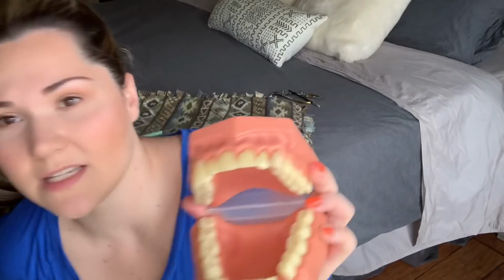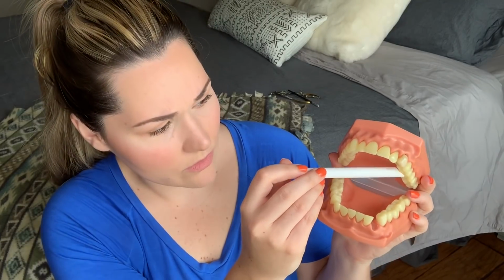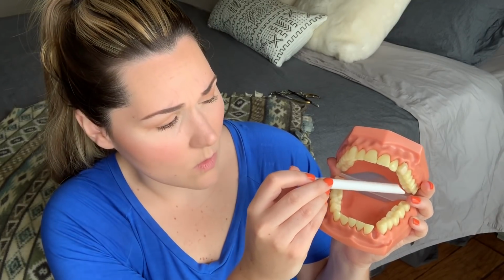So you're the assistant, you're sitting kind of like this, and the patient's down here, we'll say. The doctor's over here. So your suction, I always just kind of hold it right up against the tooth in front of it or behind it, depending on where the doctor is with the handpiece. But usually I just latch it onto the tooth, or rest it onto the tooth behind, or a couple teeth behind it, just so you're able to collect any debris that might come off.